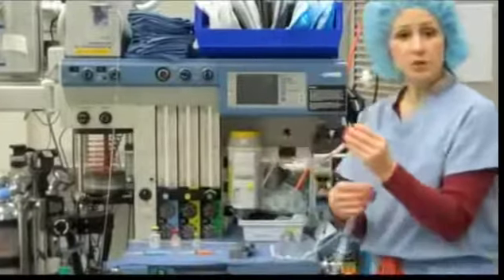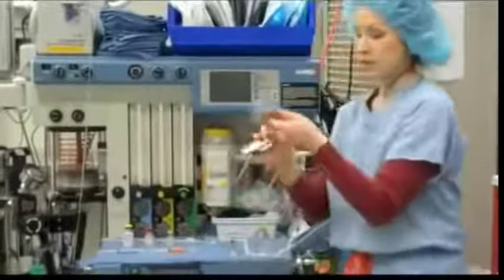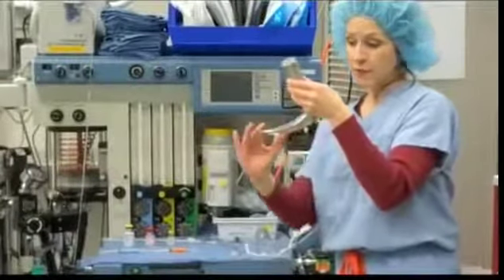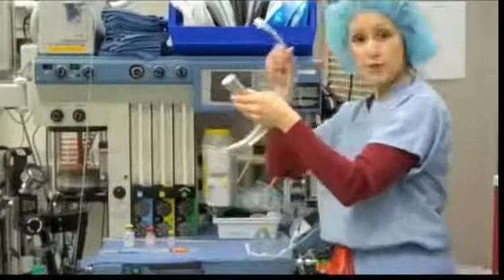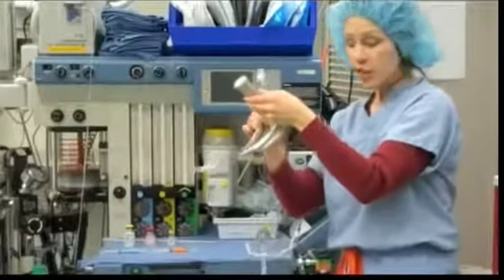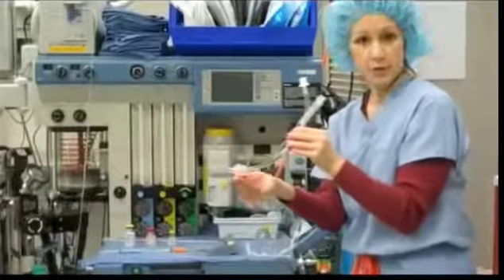This is called an endotracheal tube, or breathing tube. It is placed in the mouth with the assistance of a laryngoscope. The laryngoscope has a light at the end of this blade. It is inserted into the mouth, and it lights up the back of the throat, so we know where this breathing tube is going. Once the breathing tube has been inserted, we then gently remove the laryngoscope out of the mouth. We inflate the cuff that sits at the end of this breathing tube.